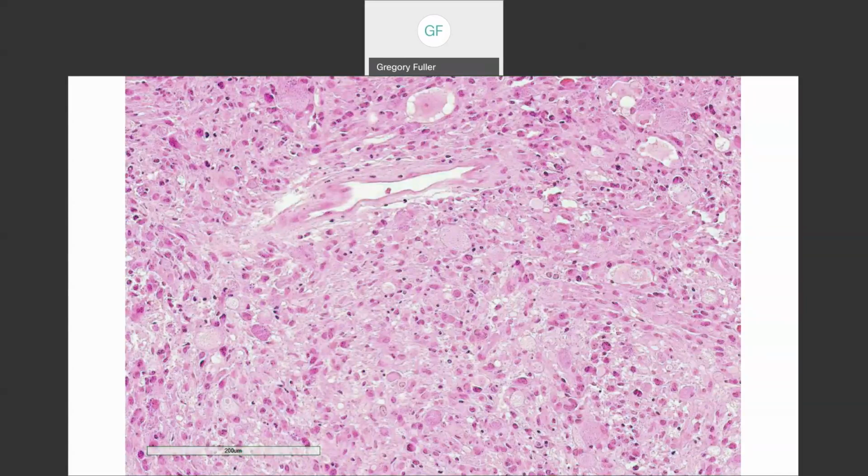The ganglion cell component varies greatly in terms of how much of the tumor it composes. In many cases, the ganglion cells are scattered. They are rare. And on frozen section, you might think, oh, beautiful PXA. And then sure enough, when you get the perms, oh, some of these guys look like they have Nissl substance. You run NeuN, synaptophysin, they light up. Oh, that's going to be the ganglion cells, binucleate ganglion cells. Then you've got to go to ganglioglioma.